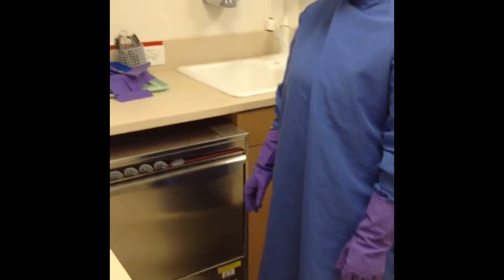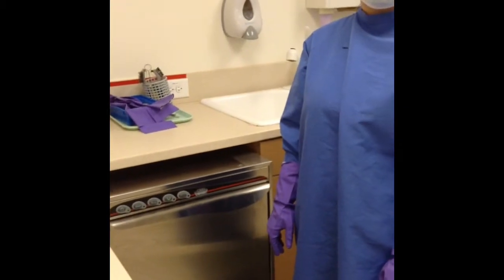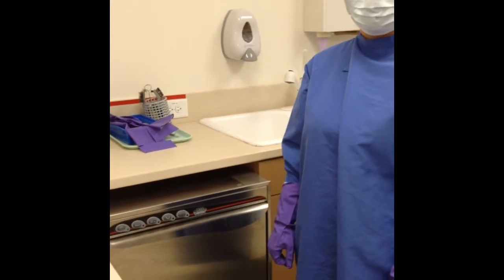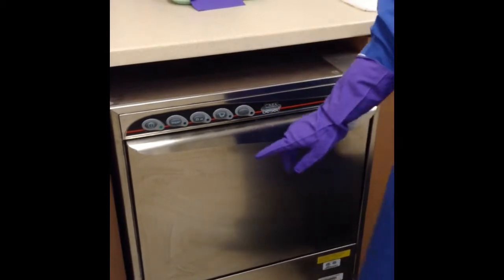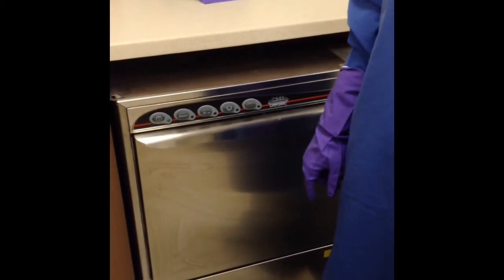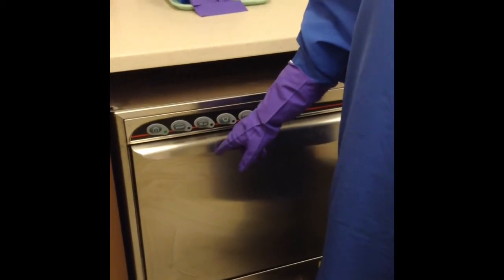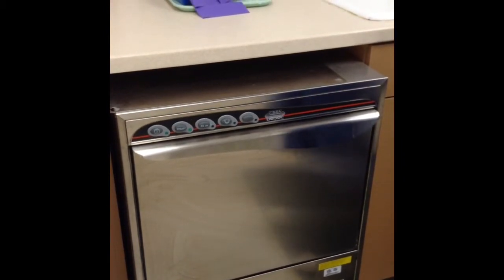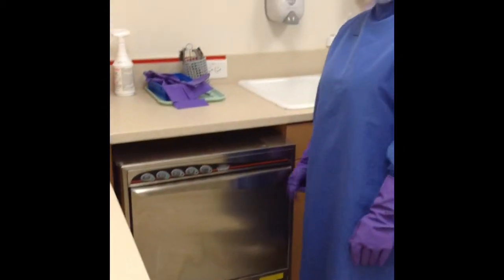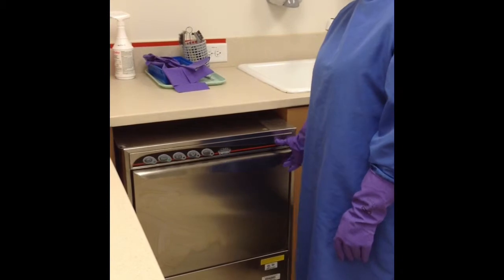Once the door is closed, you heard that click, and she is going to press the power button. You wait for the water to fill up and for the washer to heat up. We are listening for the end of the water cycle to know that it is done. We heard the water stop — that is how we know the instrument washer has completed its cycle. Now you push the start button. We heard the instrument washer stop running and Krista is ready to take the cassettes out and place them on the towel.